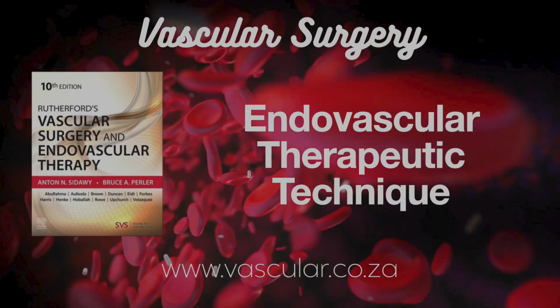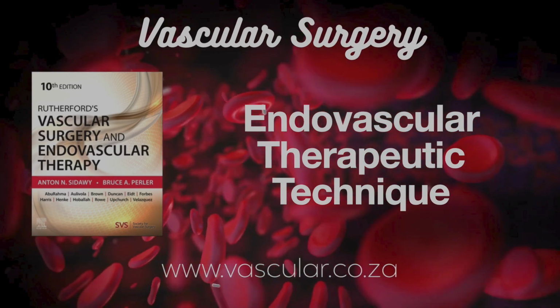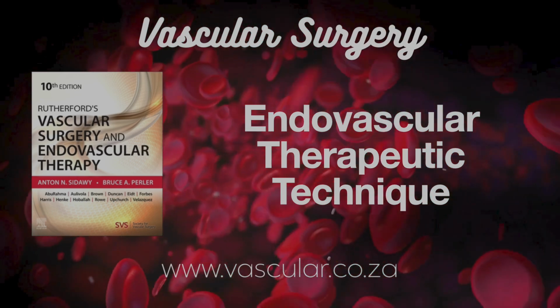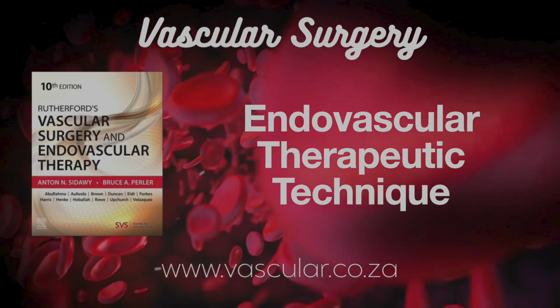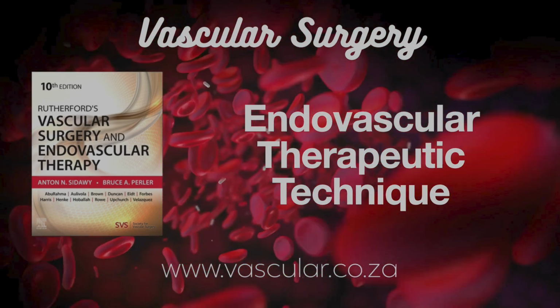For DVT, rotational systems like the Cleaner have shown good technical success and patency. And interestingly, the source mentions stent retrievers, like for stroke, being used peripherally. Absolutely. Devices like Solitaire and Trevo, designed for removing clots in the brain during stroke, are being used off-label in peripheral arteries, especially for tricky acute limb ischemia when aspiration fails, or for clots in small below-the-knee arteries.